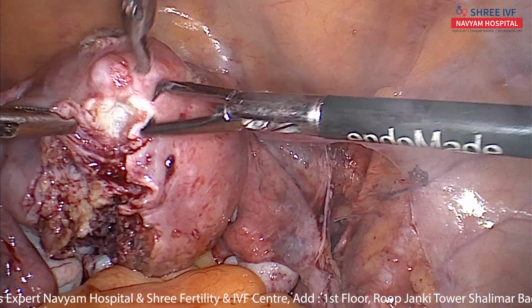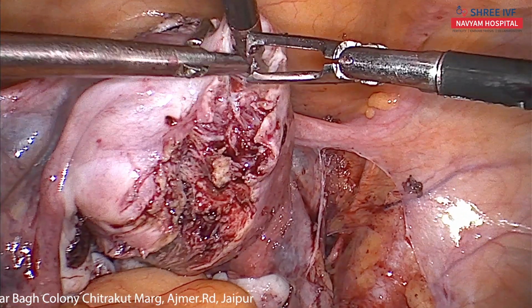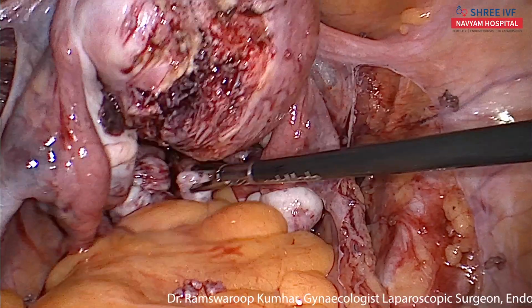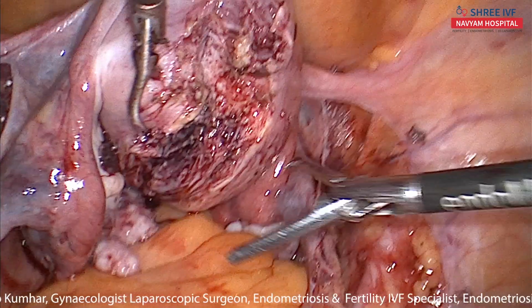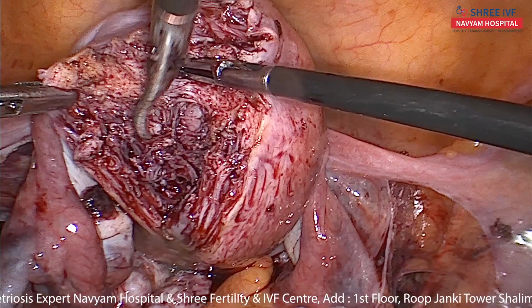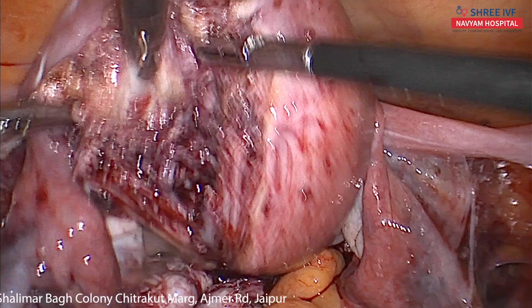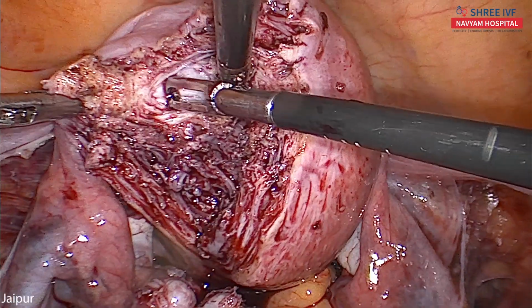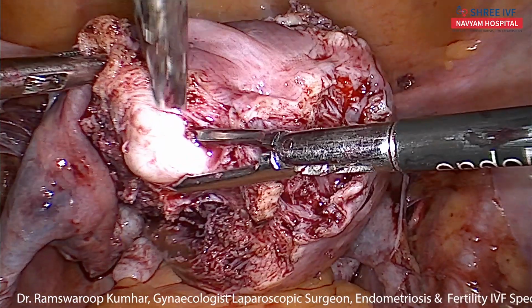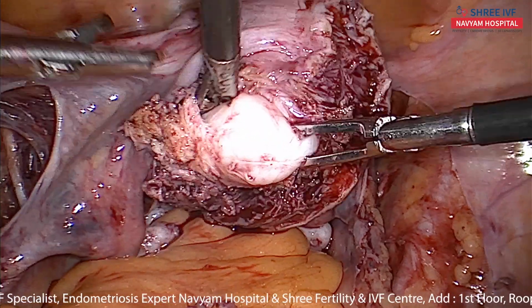We will remove it out. Okay, hold it. This one, 12 myomas. And one more myoma on this side, big. One layer is remaining. Pushing it back by the blunt traction and the myoma will be out.